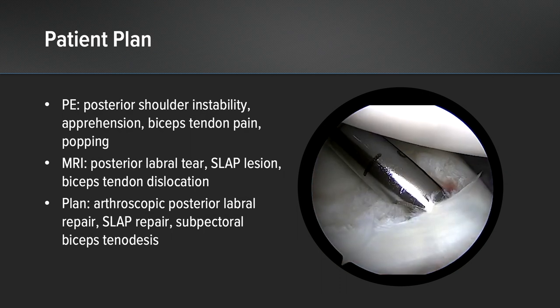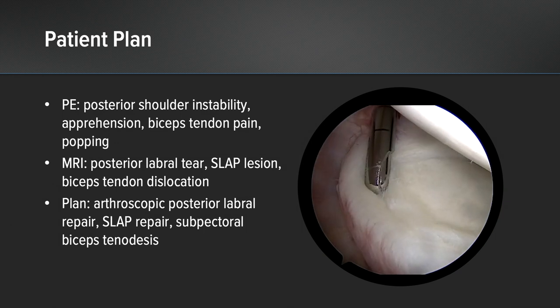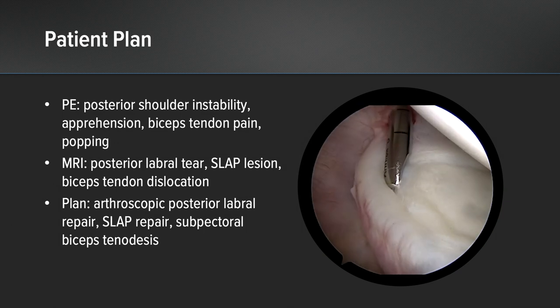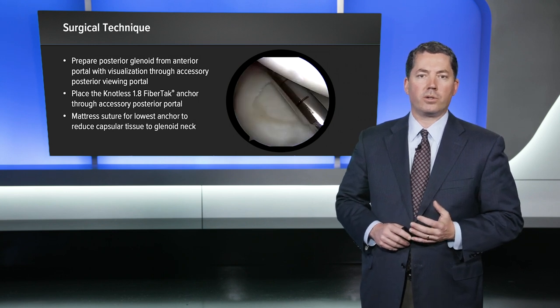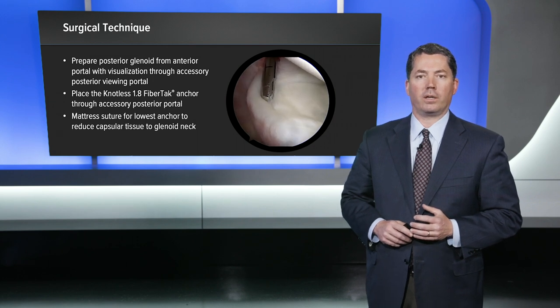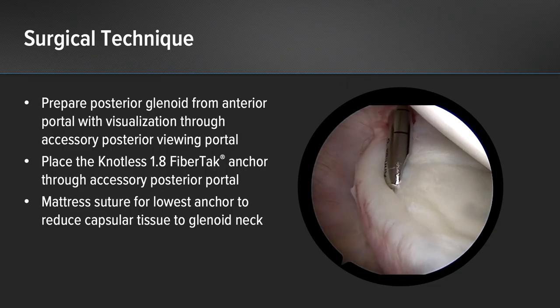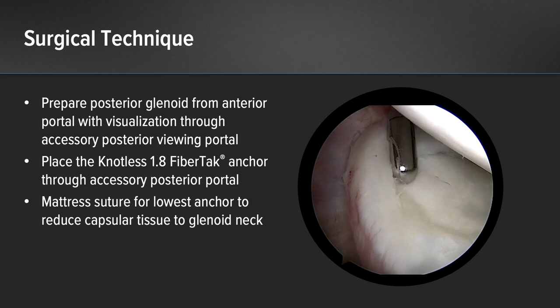The plan for her surgery was to do an arthroscopic posterior labral repair, a SLAP repair, and a subpectoral biceps tenodesis for the bicep tendon dislocation. For the surgical technique we have several pearls. It's much easier to prepare the posterior glenoid from the anterior portal, so in this case I'm visualizing through an accessory posterior viewing portal. The shaver is coming through the anterior soft spot or rotator interval portal, which is the easiest way to prepare the posterior inferior glenoid.